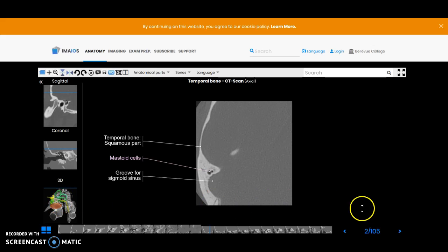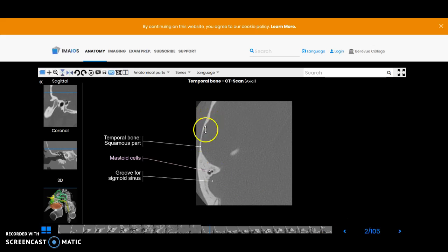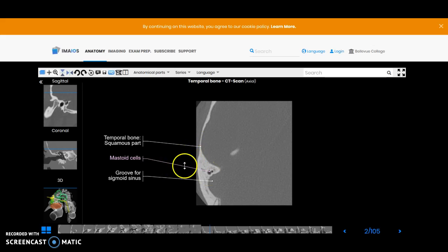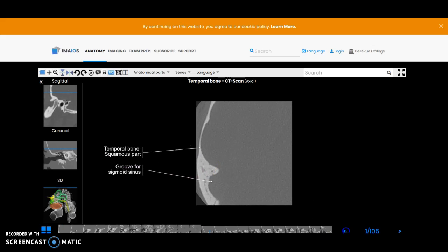I'm going to start sliding through these slices here. This again is the right side of the patient. You've got a little bit of the mastoid air cells here and we'll be coming into the right auricle and pinna as we move inferiorly.